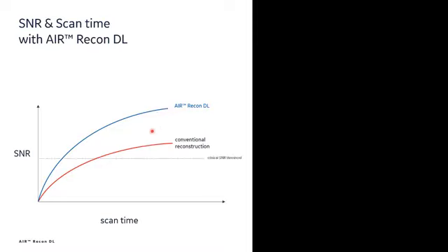And if we were to, again, give our clinical SNR threshold and our clinically acceptable scan time threshold, because maybe that's 3 minutes, maybe that's 5 minutes, but there is a number that clinics will want to have scans under. We have point A, we have point B, which gives you a much shorter scan time with the same SNR.